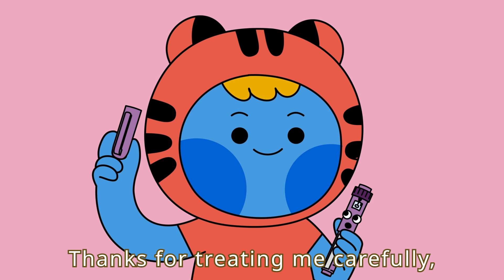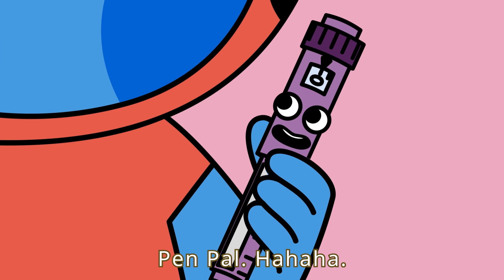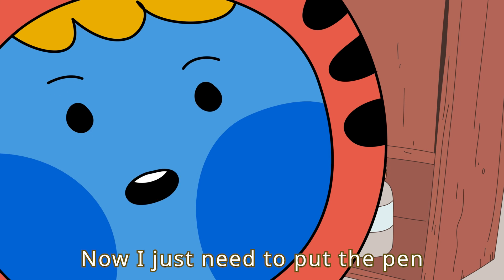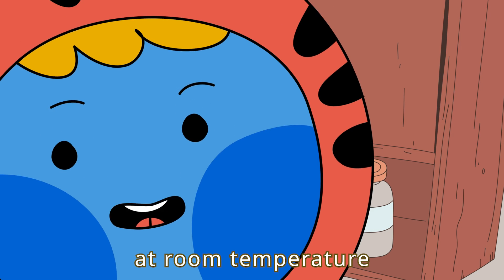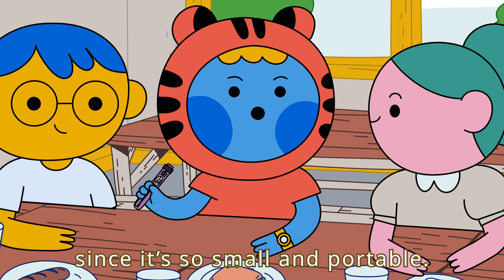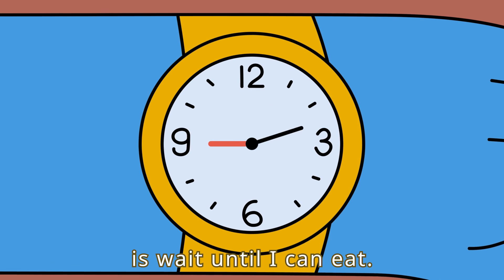Thanks for treating me carefully, Betty! Thanks for your help, Penny — you're a real pal! Pen pal! Good one, Betty! Now, I just need to put the pen in a clean place at room temperature until my next injection. Or, I can bring it with me since it's so small and portable. All that is left to do is wait until I can eat.